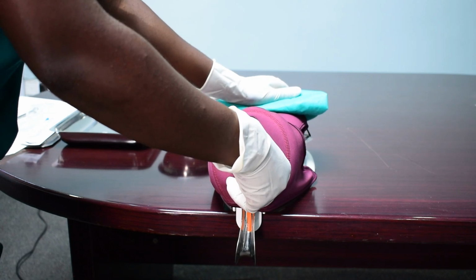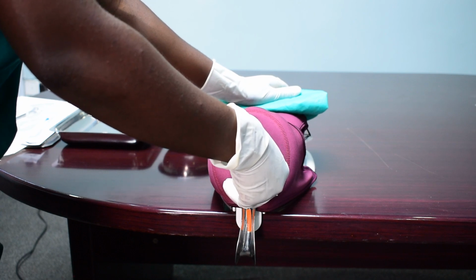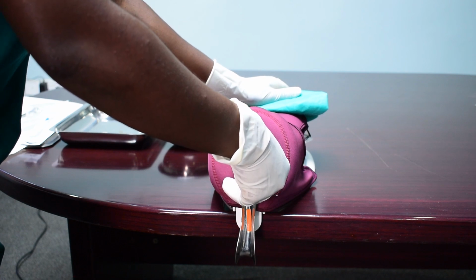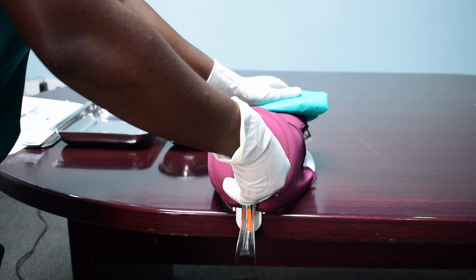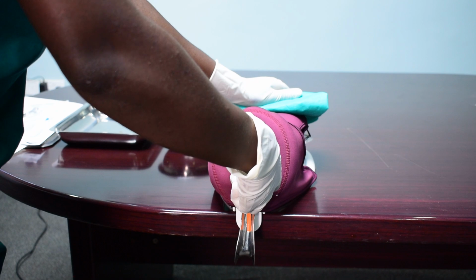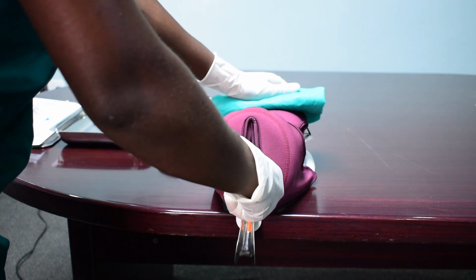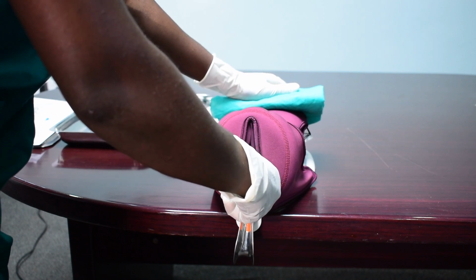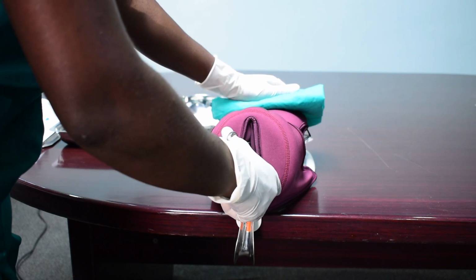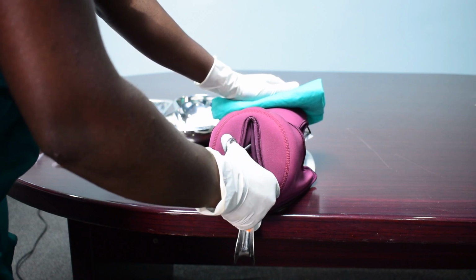But now we have to be gentle. Because if you're using lots of force, you can cause trauma or even perforate the uterus. So we shall now open our Kelly forceps to release the IUD. So we do this gently and with skill and technique. So when we release the IUD and we are sure it has been released at the right spot, we will slightly move our Kelly forceps to the side.